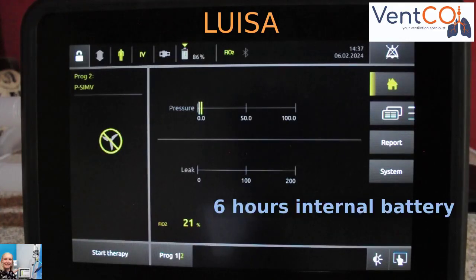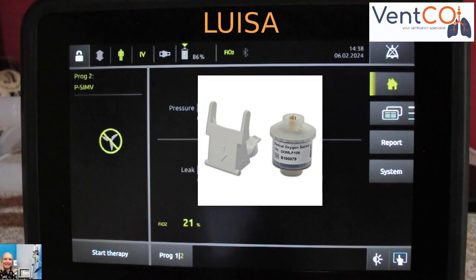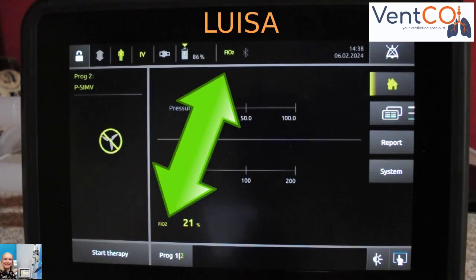Battery run time of the Luisa is 6 hours. You can get an optional extra two hot-swappable batteries, prolonging the run time to a maximum of 18 hours. A FiO2 cell for FiO2 monitoring can be inserted into the back of the Luisa.